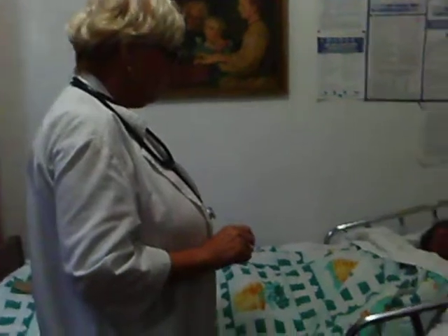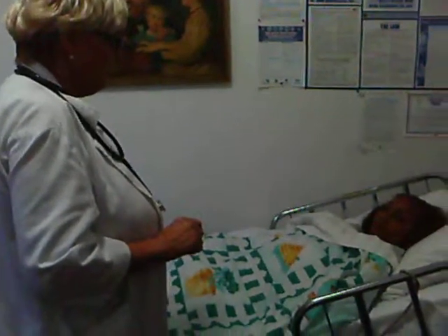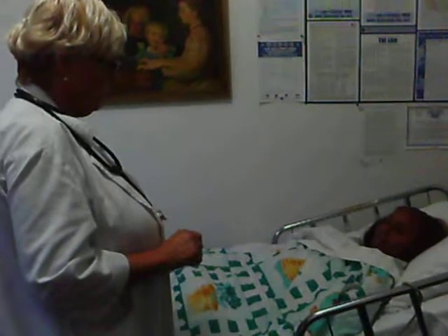Good morning, my name is Helena. I am your CNA student for today. I am going to check your weight today. Is that okay for you? Yes.